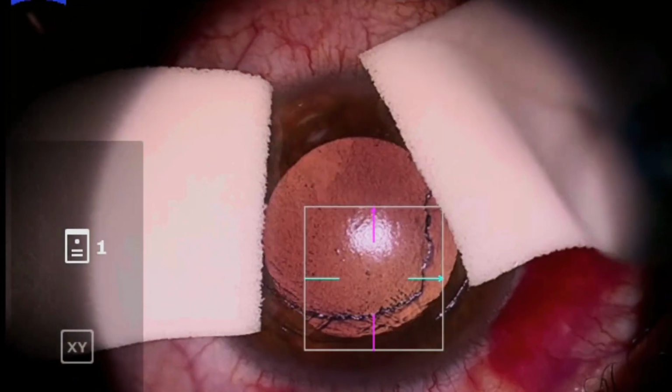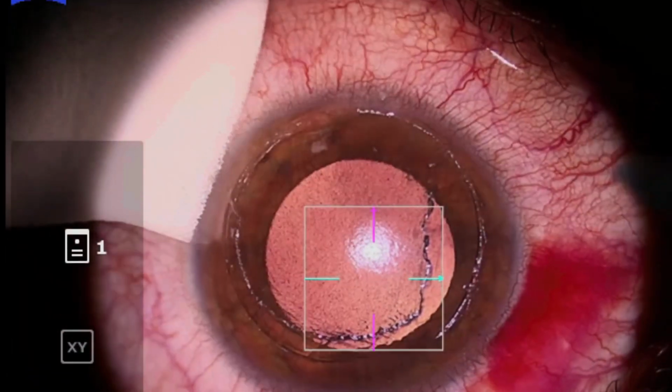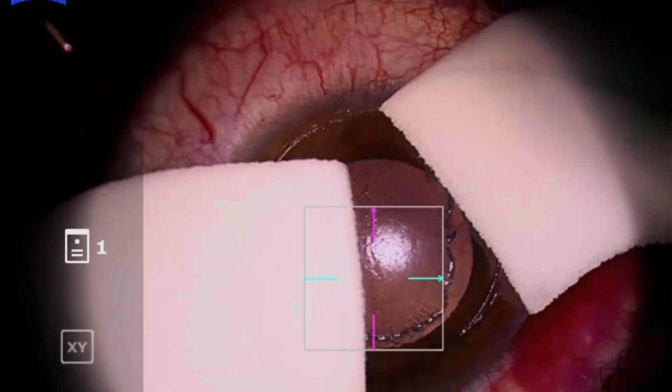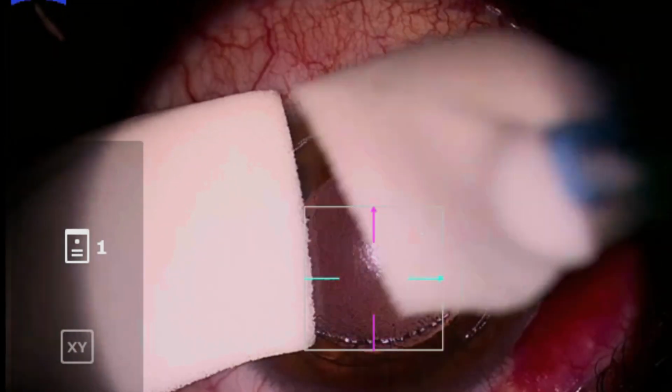Using the flap double twist technique, the flap is carefully twisted obliquely and sequentially in 2 opposite directions while applying gentle pressure on the flap in order to completely dehydrate the flap and the stromal bed. The patient did fine with 6/6 vision.